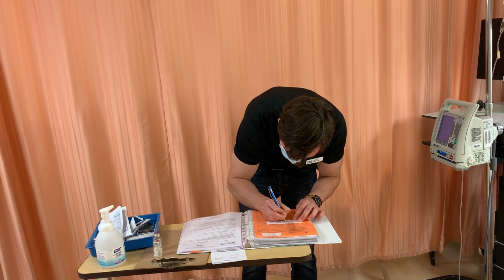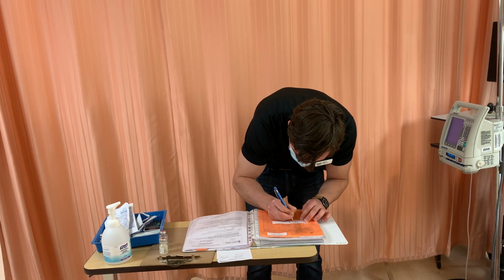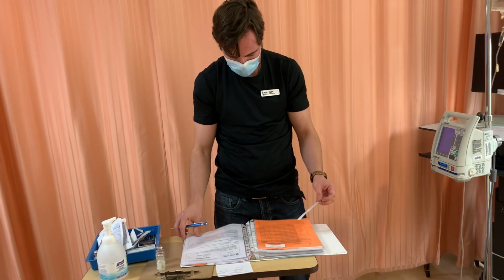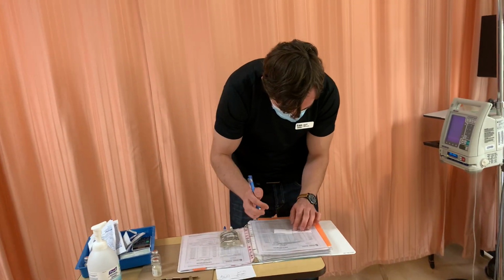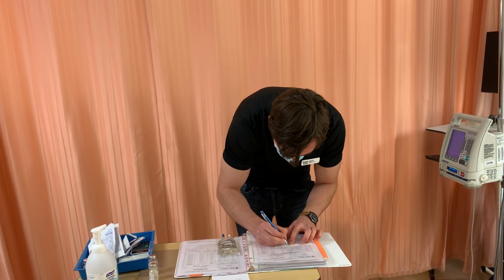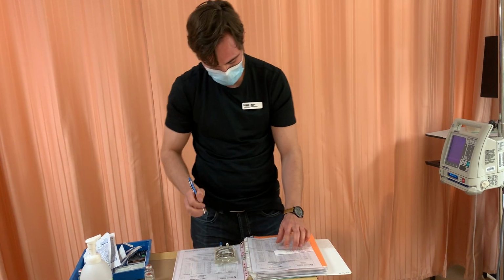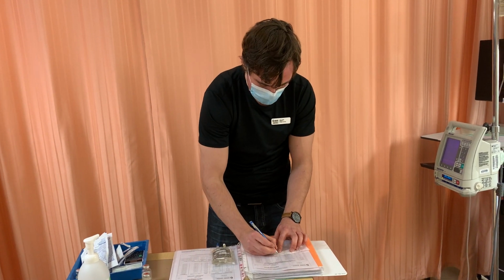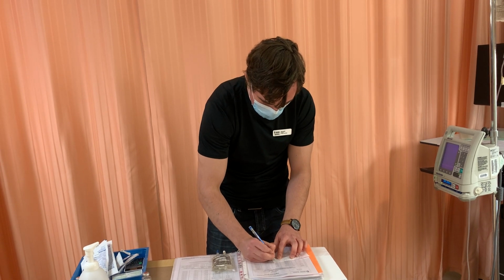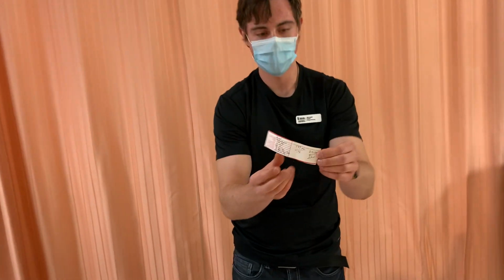So now I have a total. I'm going to put my medication into this bag. And I have figured out here, I have a volume of 110 ml, and I'm going to be running that over 30 minutes. So that means I'm going to have to run my pump at 220 ml per hour.